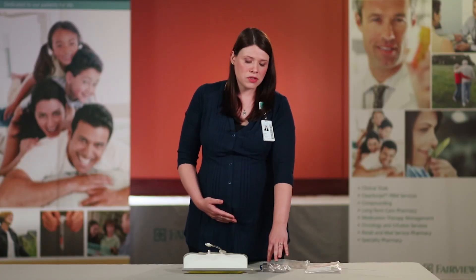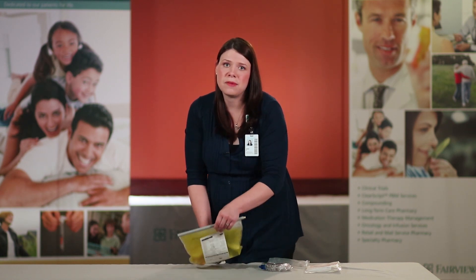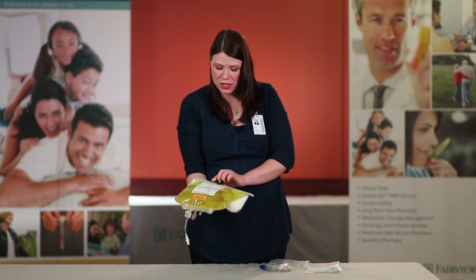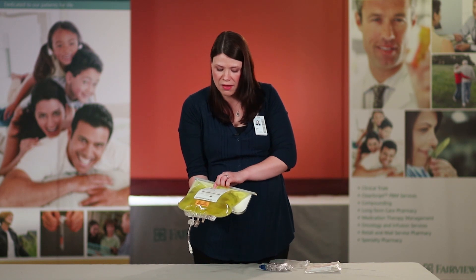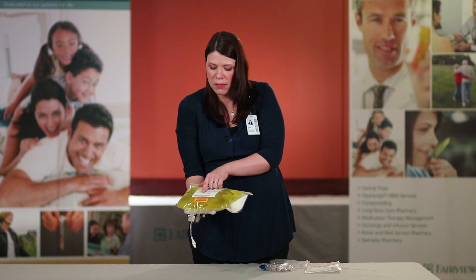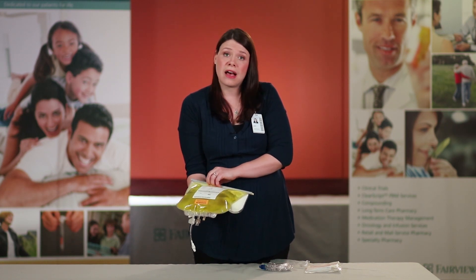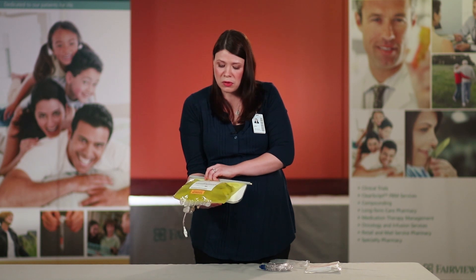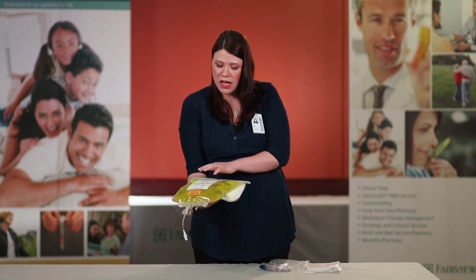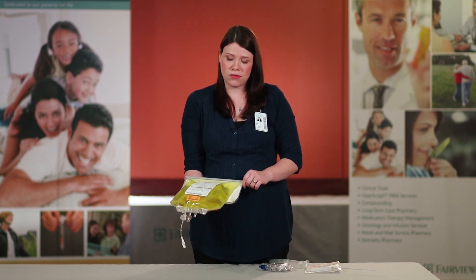In this chapter we will be discussing how to mix your TPN and how to spike your TPN bag. The supplies that you will need is your TPN bag. You want to ensure that it has your name, the date of birth, the correct medication, and also remember to pay attention to the beyond use date. If it is past that date you want to not use this bag. If any of this information on this label is incorrect please call Fairview Home Infusion.